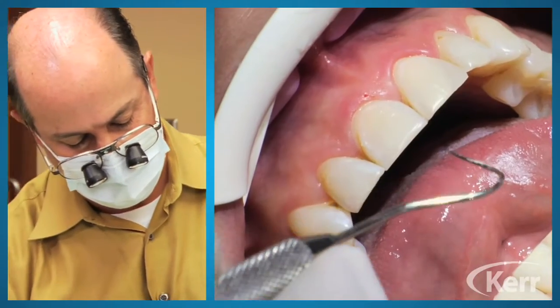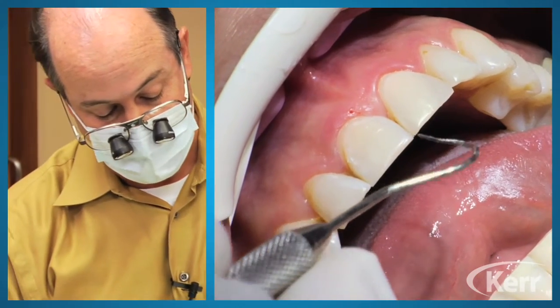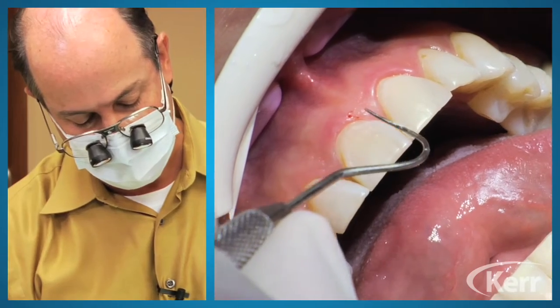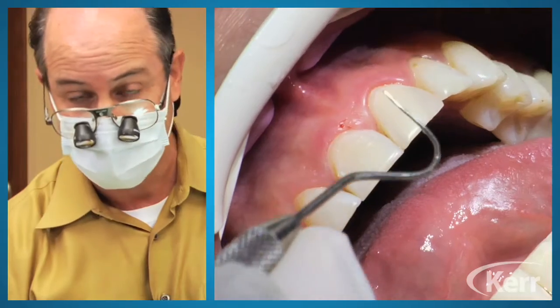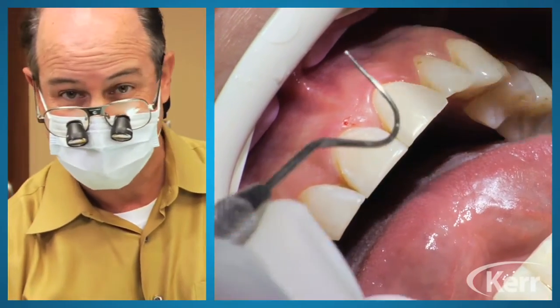Yellow. So I think you can see how we really took this tooth with a small chip in it, put a small bevel, then etched, primed, and bonded, and then placed this Herculite Ultra. The one thing I didn't point out earlier was that it doesn't slump: you can actually sculpt it and push it where you like it. The sculptability is very nice. The fact that it doesn't slump is fabulous, but you also notice that it didn't stick to the instrument.